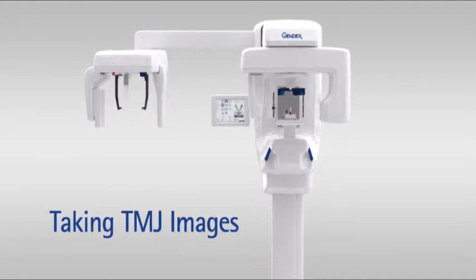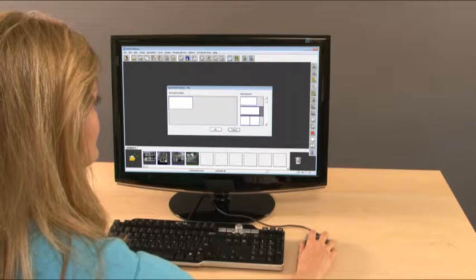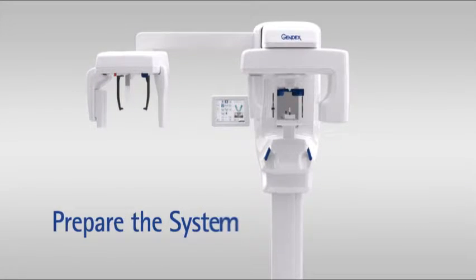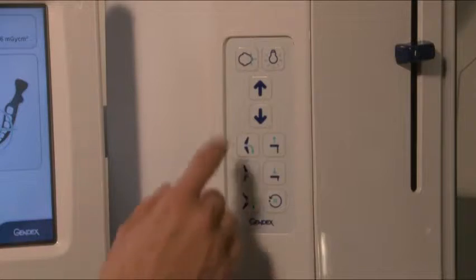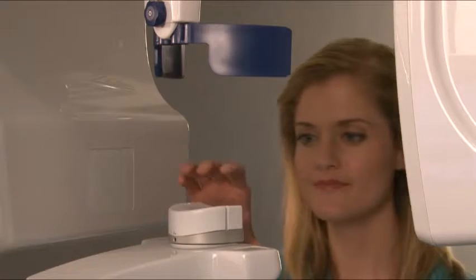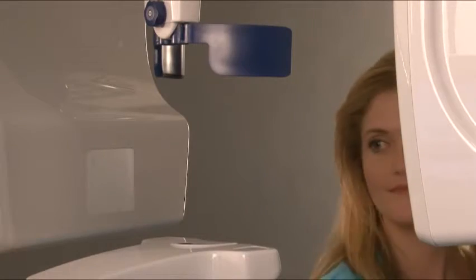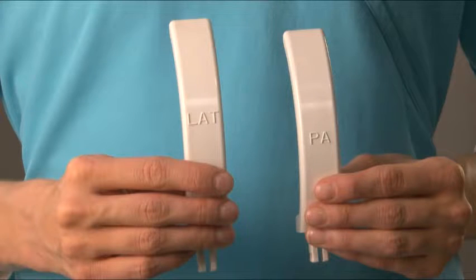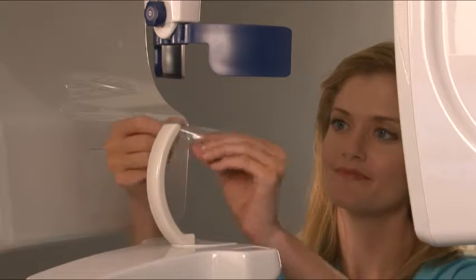Taking TMJ images. Set up the acquisition from within your imaging software. Prepare the system. Press the patient positioning button to rotate the unit to the patient in position. Remove the chin rest from the support holder, then place the TMJ nose support into the support holder. Use the short nose support for large and medium adults, and the long version for small adults and children. Place a barrier on the nose support.